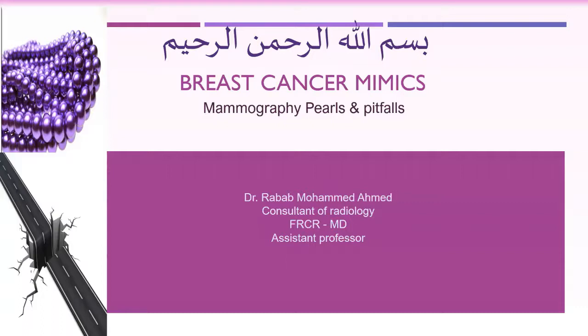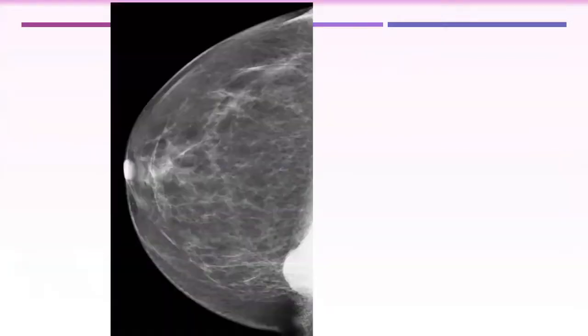Continue talking about mammographic pearls and pitfalls. Today we are giving the counterpart for the false negative. Today we are going to talk about the false positive.